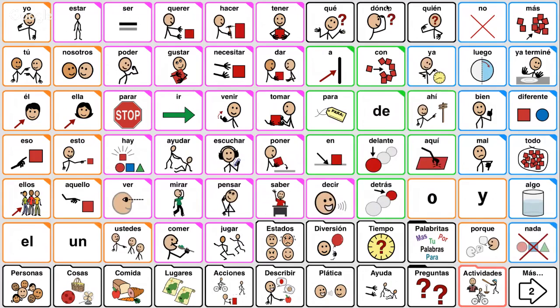So now, this is the Spanish version of the same vocabulary. As you can see, the general layout is the same. We have on the left the pronoun area. Here, the pink, we have all of the verbs. We have the prepositions, the adjectives, adverbs, conjunctions, and question words. But if you look closely at the different parts of the vocabulary, they don't have the same shape. You have a different number of verbs in English versus Spanish, and a different number of pronouns in English versus Spanish. And when you think about how the languages work, it makes all the sense in the world.